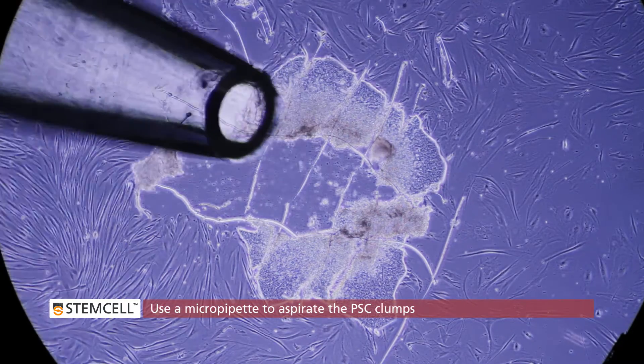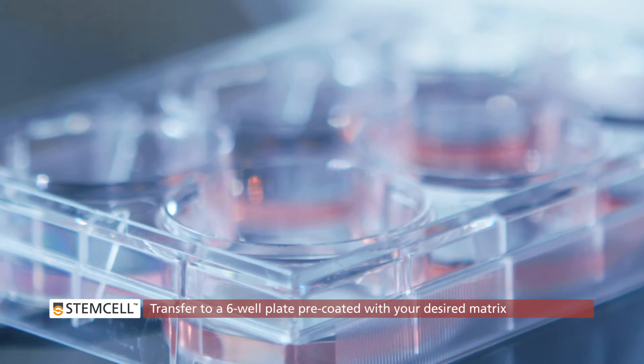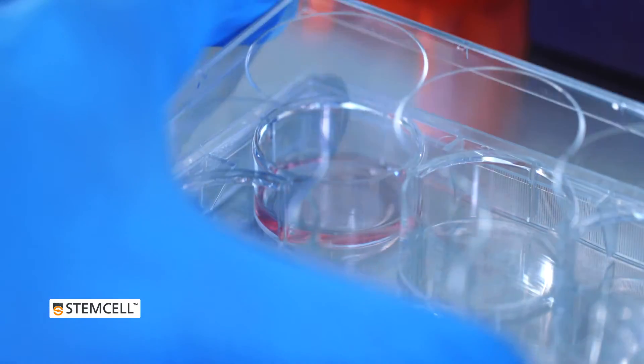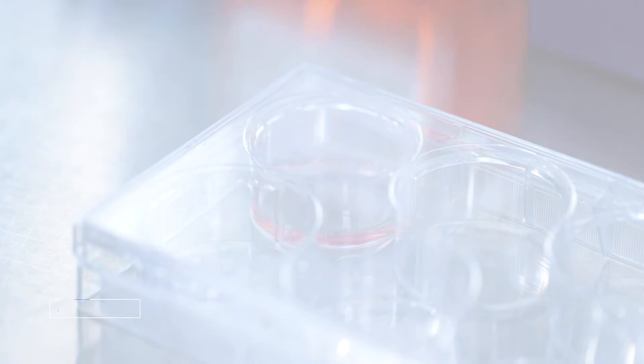Immediately plate the harvested colonies onto cultureware pre-coated with your desired matrix, such as Matrigel or Vitronectin XF, with mTeSR1 or TeSR-E8 media.